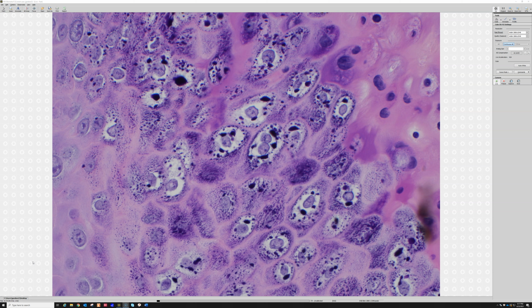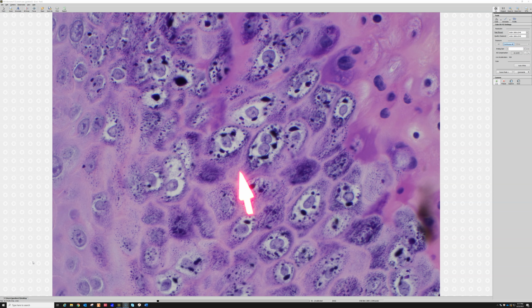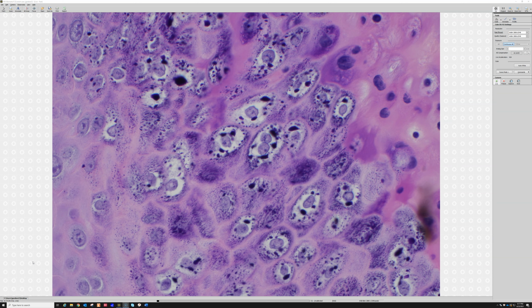So warts often have hypergranulosis. I'll show you some other examples. But not only is the granular layer thickened, but the actual granules themselves, these purple things, are called keratohyalin granules. If you need a refresher on this, I've got a whole hour-and-some-minutes video about skin histology that you can go over. I'll put a link down below. But the granules normally are tiny like this, and they're in this top layer of keratinocytes. But here the granules are clumping together. They're coalescing, kind of is one term that's been used, and I like that term, that they're all pooling together to make mega granules, like massive granules.